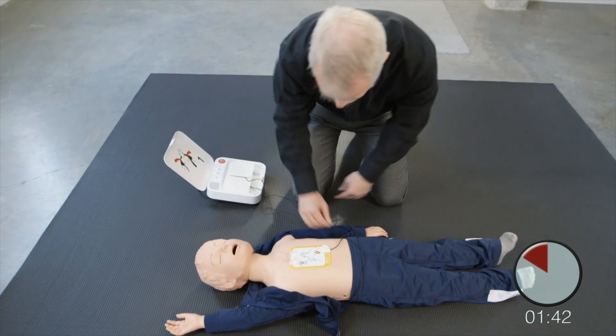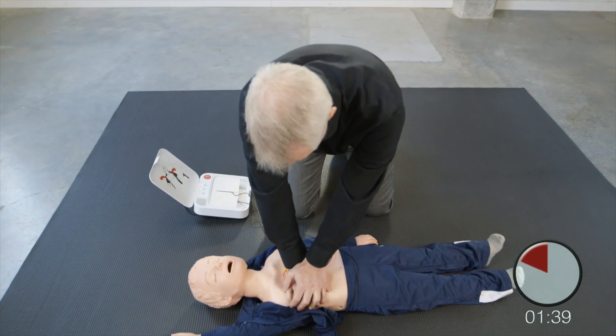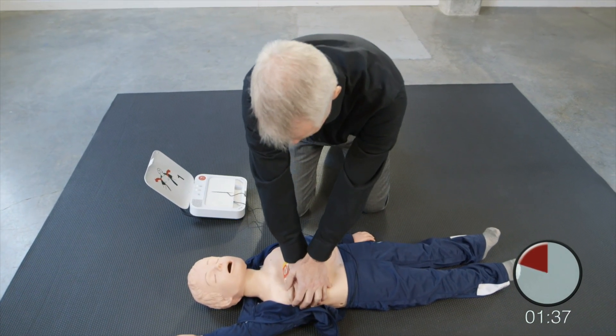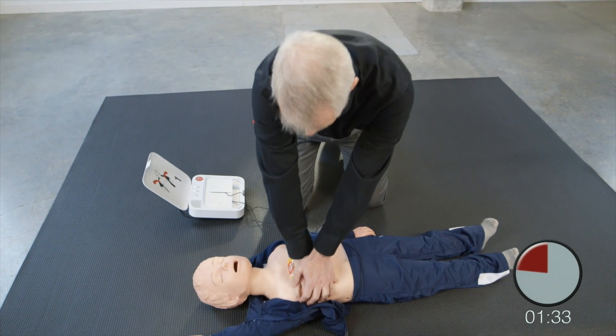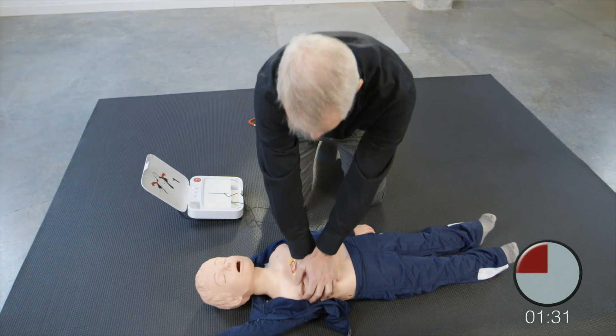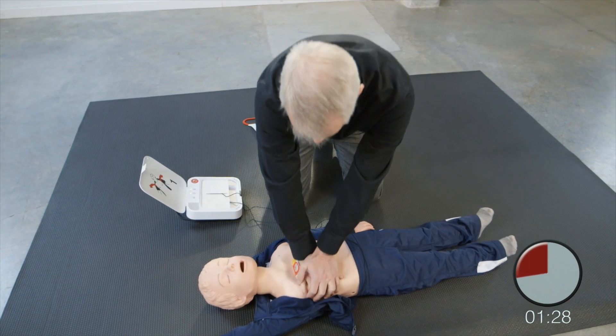Resume chest compressions. Push down deep. Push down deep. Provide two breaths.